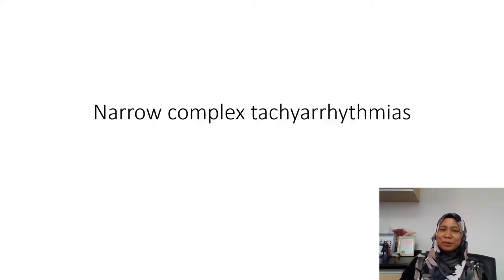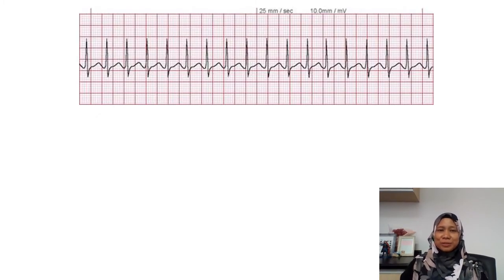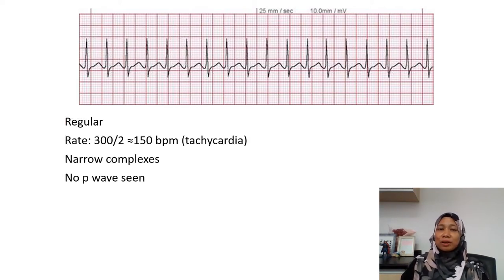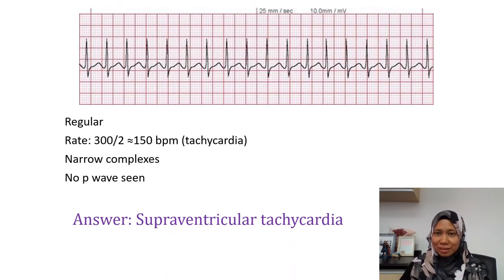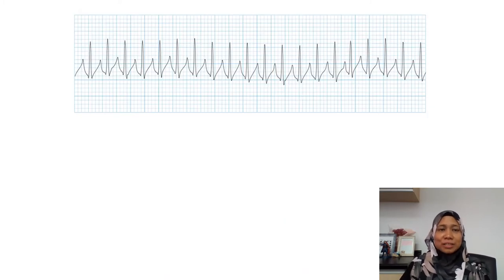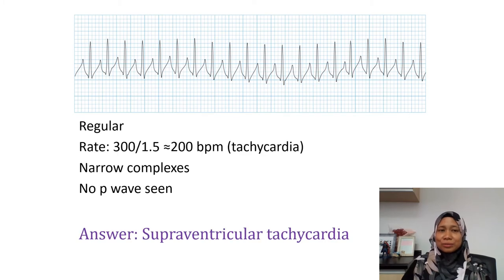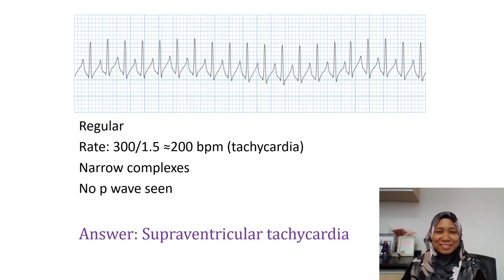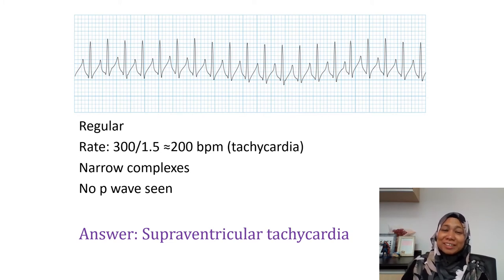Now let's go to narrow complex tachyarrhythmias. The first ECG strip is regular, about 150 beats per minute, narrow complexes, and no P waves seen — this is supraventricular tachycardia. The second strip is also regular, at about 200 beats per minute, narrow complexes, and no P waves seen — this is also supraventricular tachycardia.